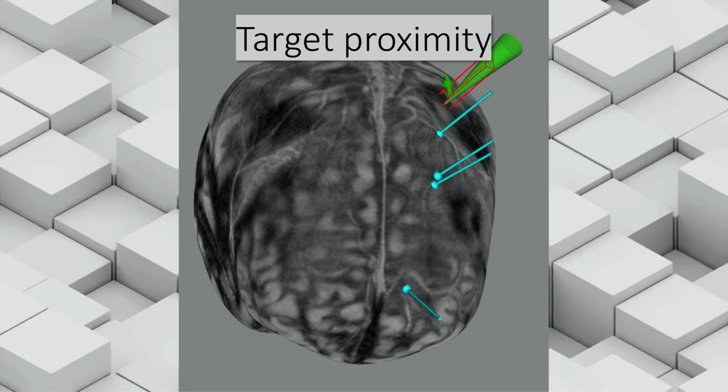Another issue is that we don't really know at the individual level how far TMS propagates through nearby brain regions, and how close we should be allowed to be with TMS targets if you're stimulating multiple brain areas. But I think that to the degree that you can, having 1.5 centimeters or so between your brain targets is probably more reasonable than having them overlap with one another. So paying attention to proximity limits some of your ability to test things.